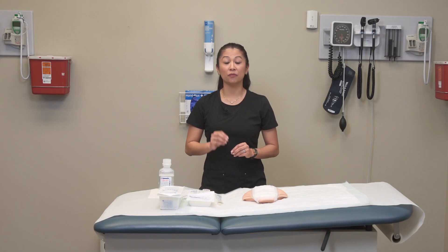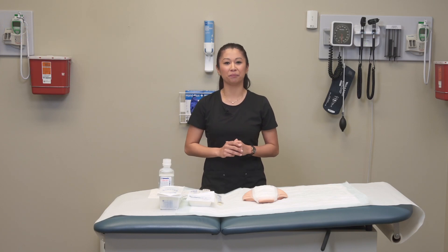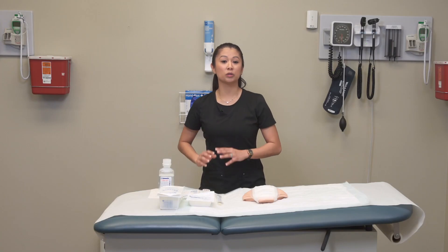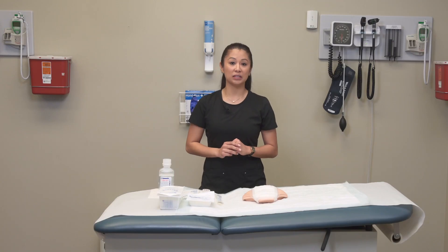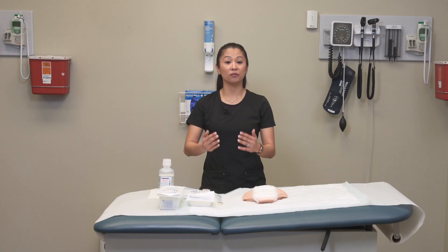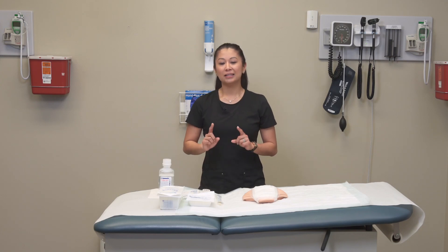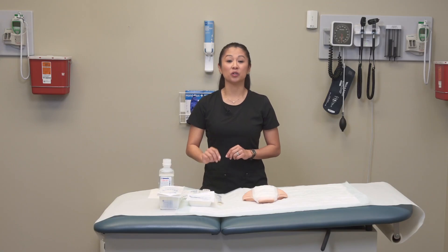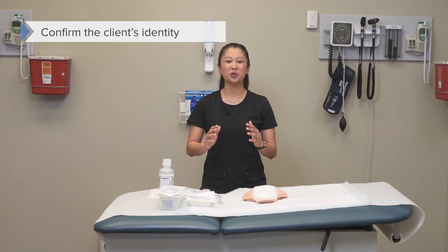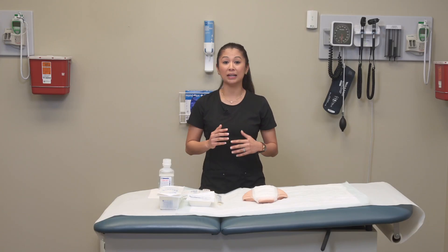Start by reviewing the healthcare provider's order for obtaining the culture — there could be some variations, so pay close attention. Gather supplies to irrigate and cleanse the wound, obtain your specimen with the appropriate swab, and supplies to redress the wound. Always provide privacy for your patient, since wounds can be on personal areas like the buttocks or abdomen. Confirm the patient's identity using two identifiers: name and date of birth.